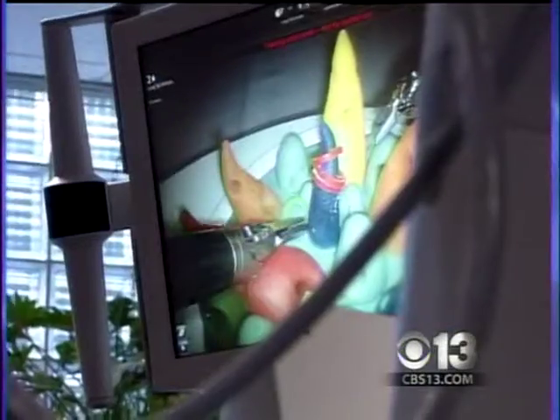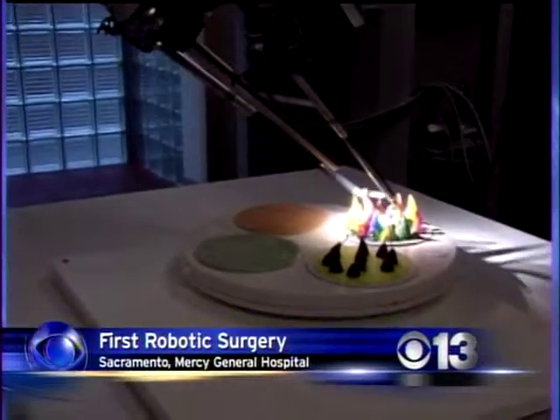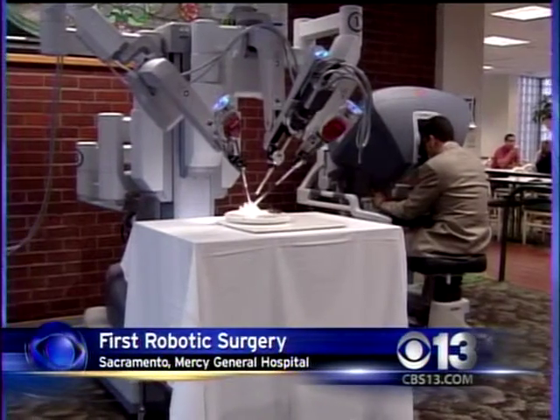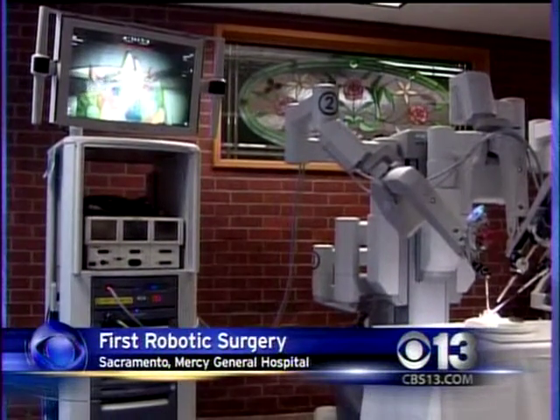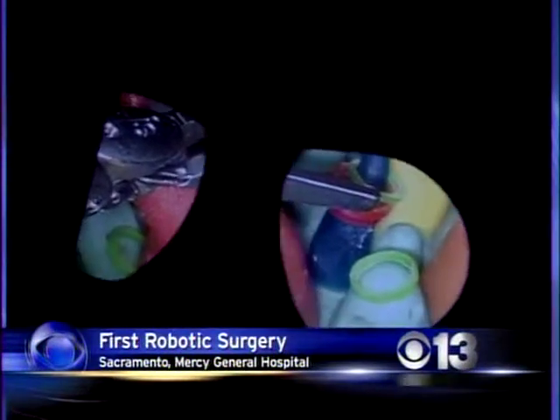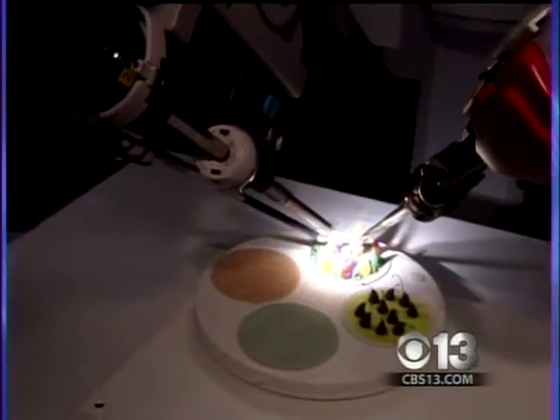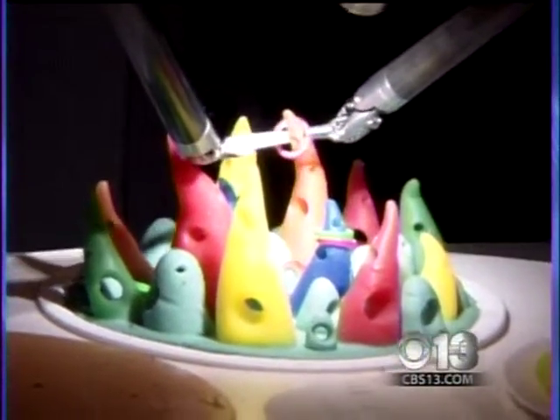And now surgery apparently has gone to the robots. Seen a little bit of this, and here's more of it. Mercy General Hospital in Sacramento performed its first robotic-assisted surgery last month. And the results, they say, were outstanding. The Vinci SI-HD surgical system is the very latest in technology for robotics, with several advantages for both patients and surgeons. The main ones are quick recovery, so the patient usually goes home the same day or the next day. Very small incisions with a lot less pain, less blood loss, and easy recovery afterward to return to activities within the first week or two.